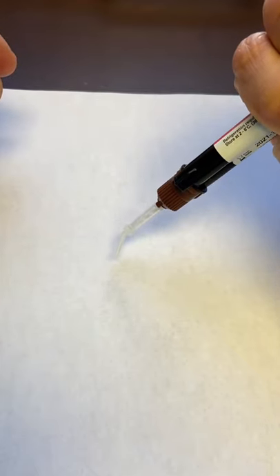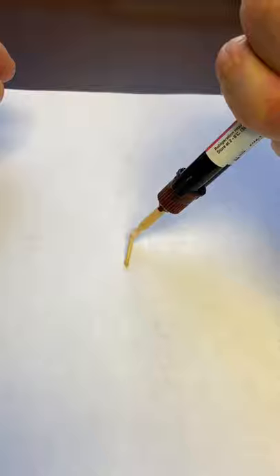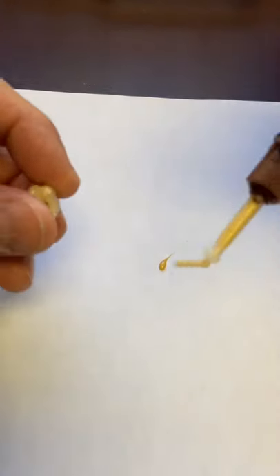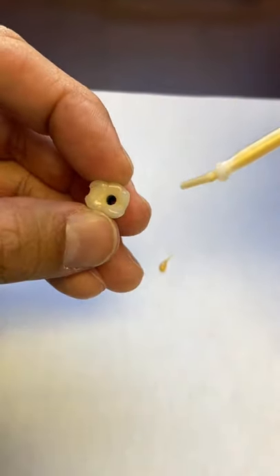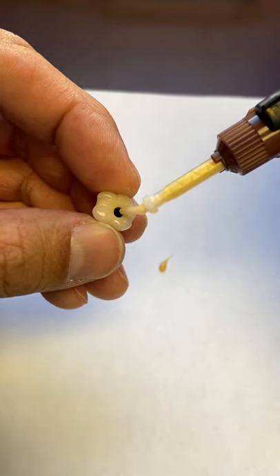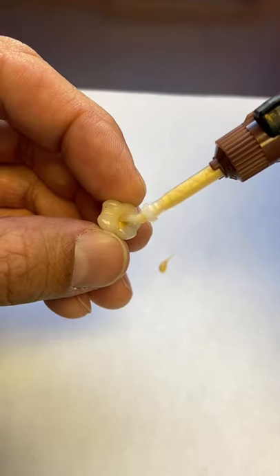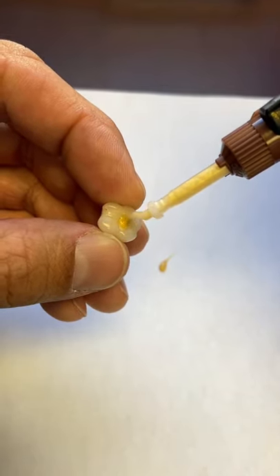A buddy of mine swears by this stuff — check this out. It's not honey brown, it's gold colored composite. He uses it for access holes in implant-supported screw-retained crowns. What that helps with is identifying down the road where the screw channel is.